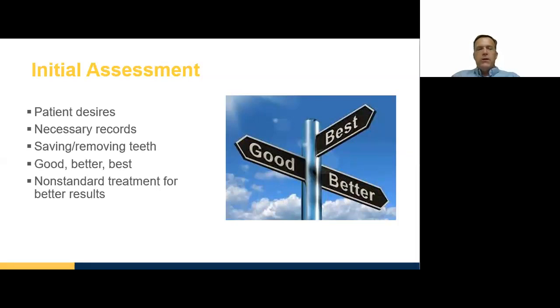So if you have a patient who has good posterior teeth, they may want to do a partial, and they may even want to use a precision attachment on there. Another thing to think about is, let's say you have a patient with some good cuspids, but they're in the wrong position. Potentially, you could do endodontic treatment and a root form locator.